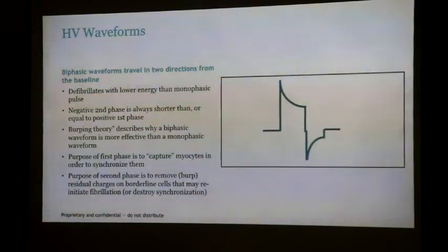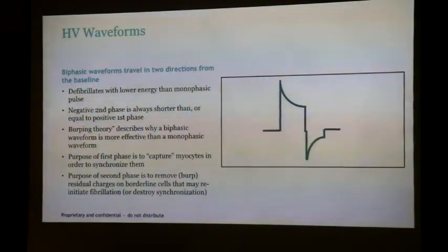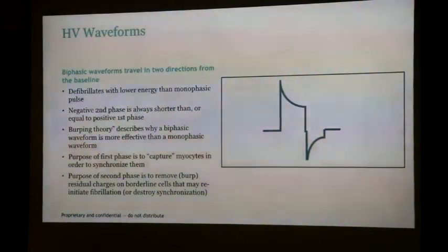So now, does anyone put dual coil leads in anymore? You all put single coil leads in? Mostly? Cheaper, easier to extract, right? So we go with the same theory that it'll be better DFT if you put it at the apex. But that data was done on dual coils, so we don't really know if that's true or false with the single coils.